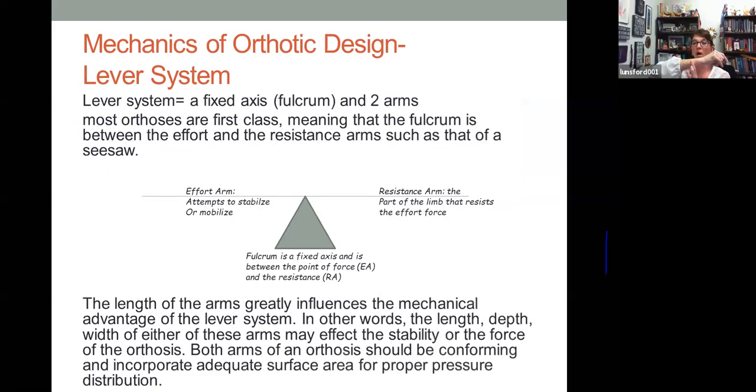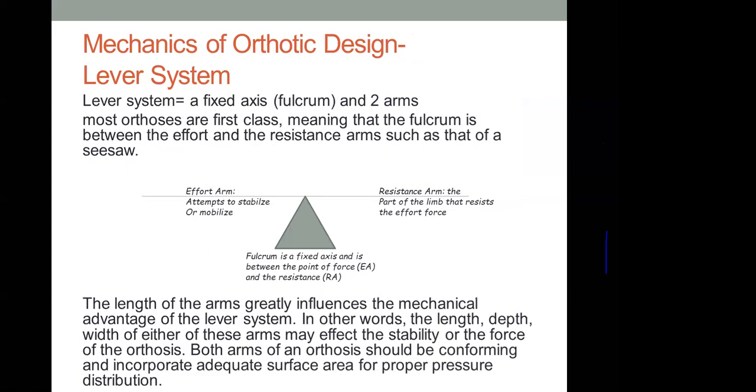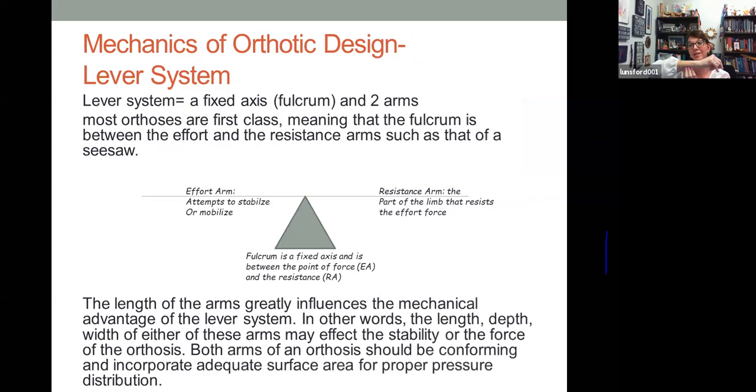Having the orthosis coming up to the edges of the forearm, as opposed to going past the edges or going below the edges. And that's your depth, right? So we don't want the depth too shy, because if it's too shy, it may not be giving us adequate stability. Plus, if it's too shy, it could be causing pressure areas on either side. So we want it to come up to the edge of the forearm so that when we apply our straps, they can make contact with the skin.